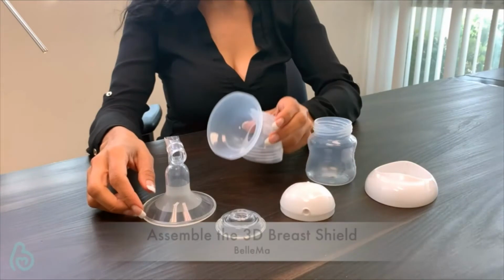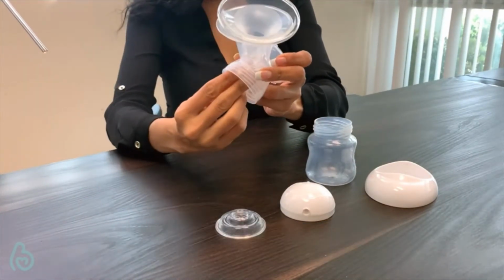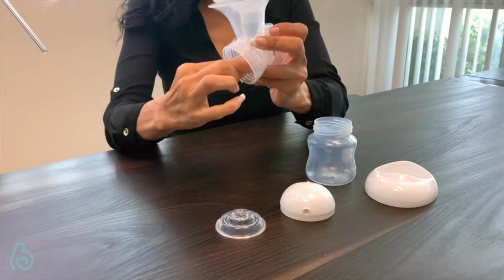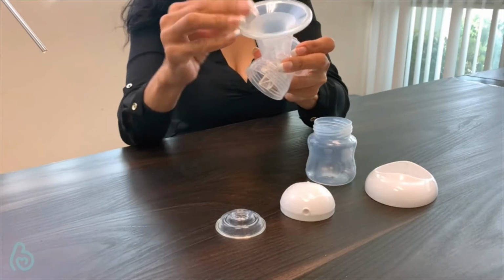The following video will show you how to assemble your 3D collection kit. First, you want to insert your silicone cushion to the breast shield body. Make sure the silicone cushion is attached correctly.